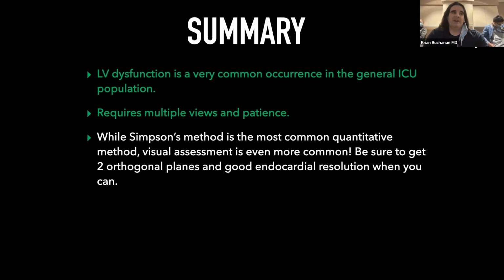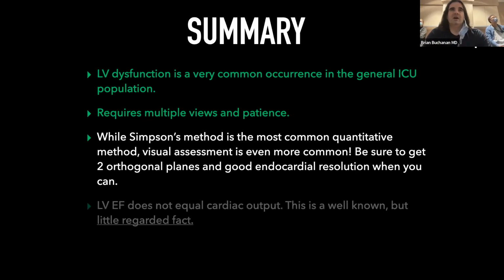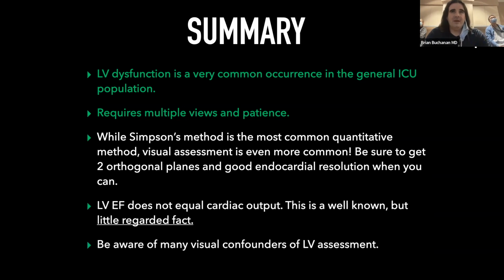From a point of care or critical care standpoint, whether emergency department or ICU, having a visual assessment with two planes and good resolution offers a lot. Be aware of this whole idea about LVEF and cardiac output, and be aware of the many visual confounders, like tachycardia and bradycardia, and also, as we talked about, the regional wall motion abnormalities.